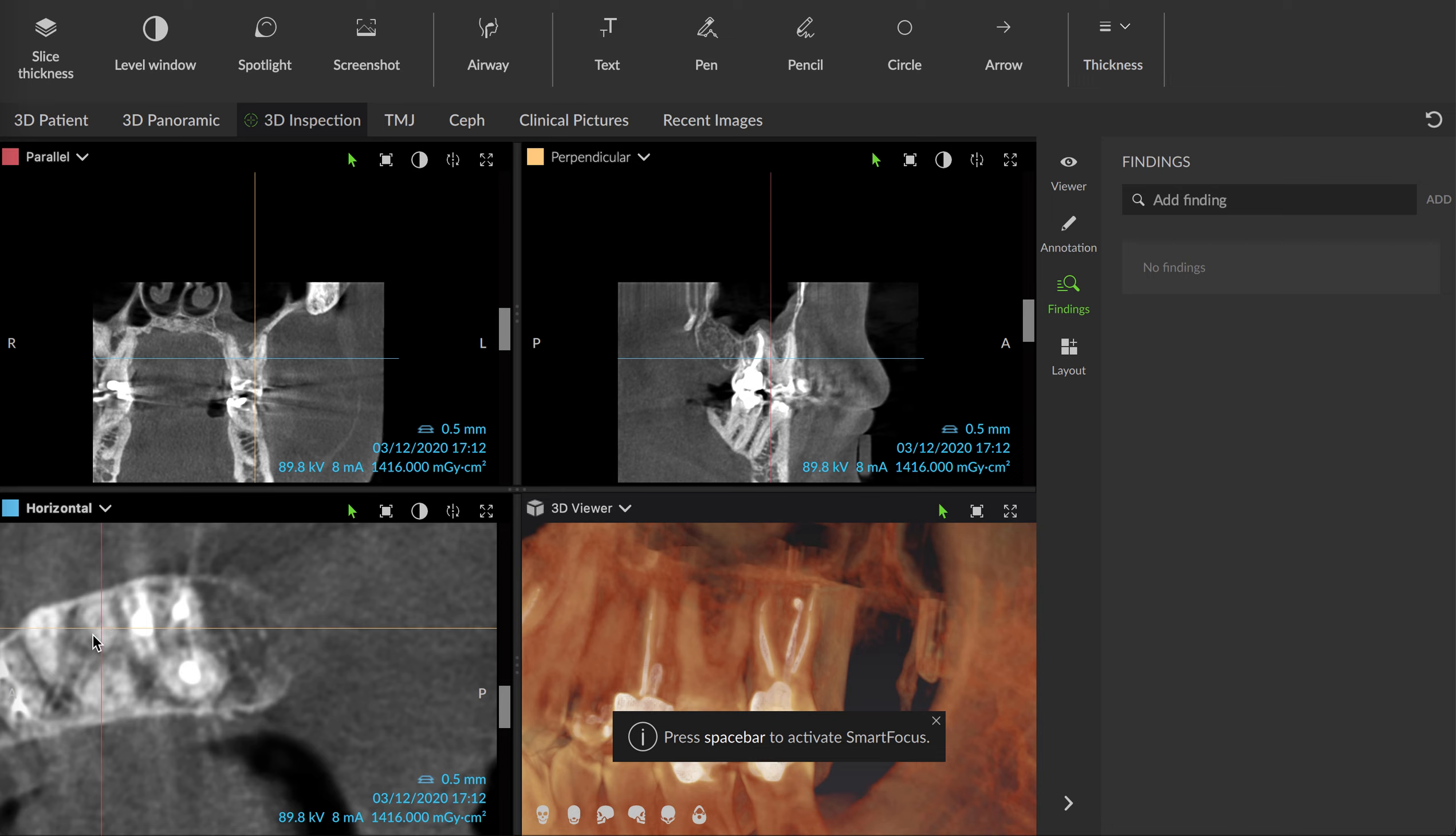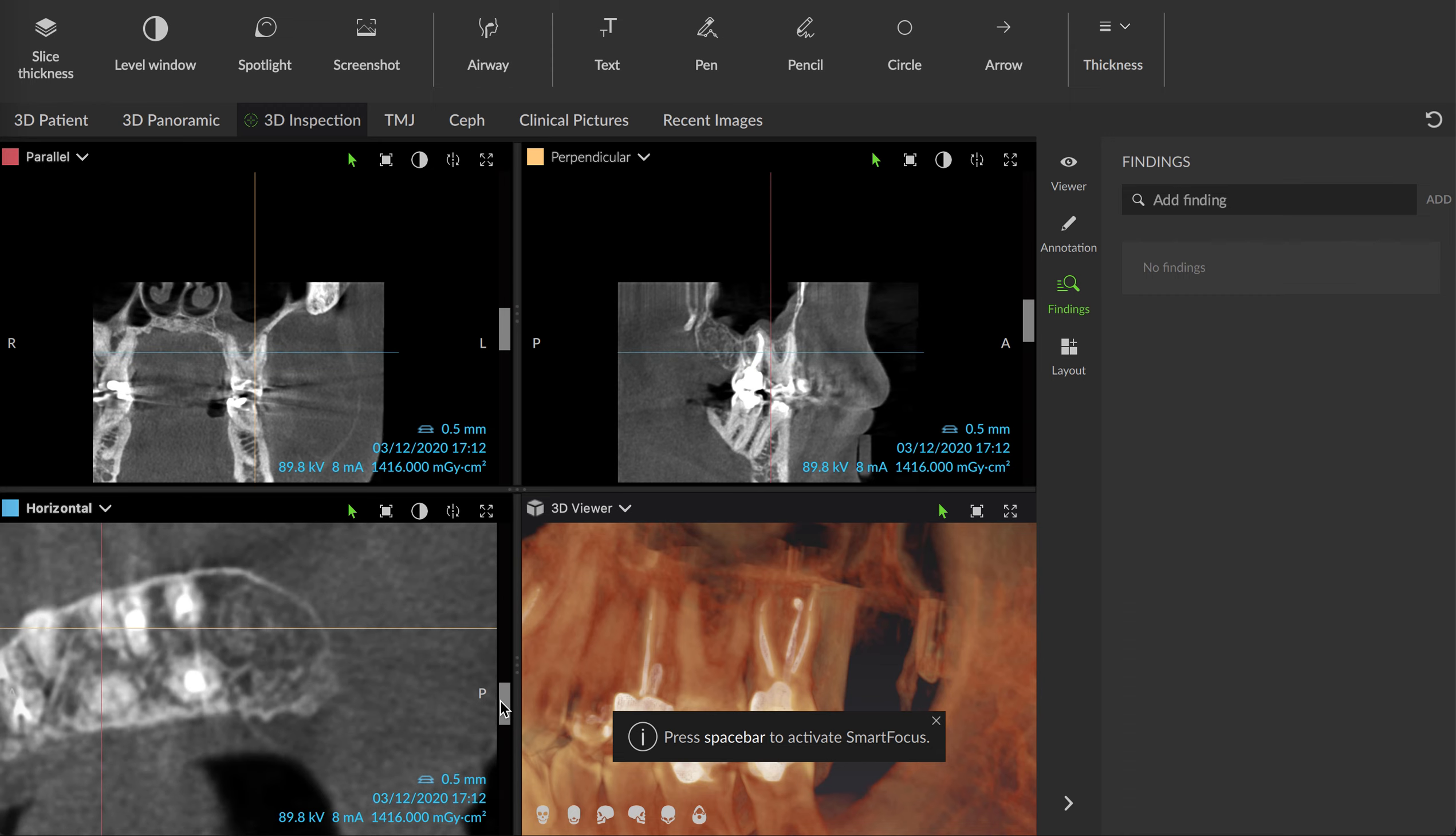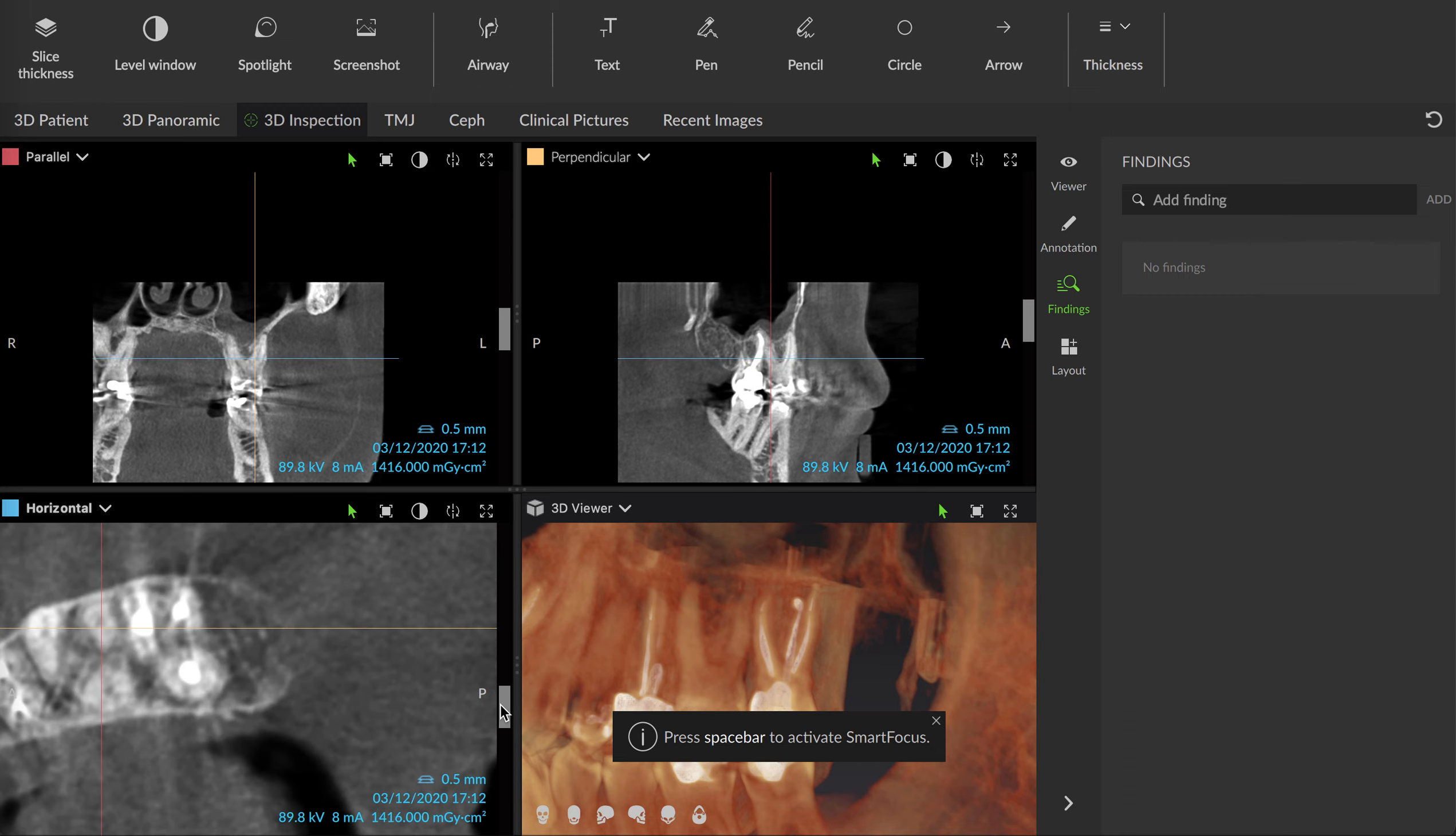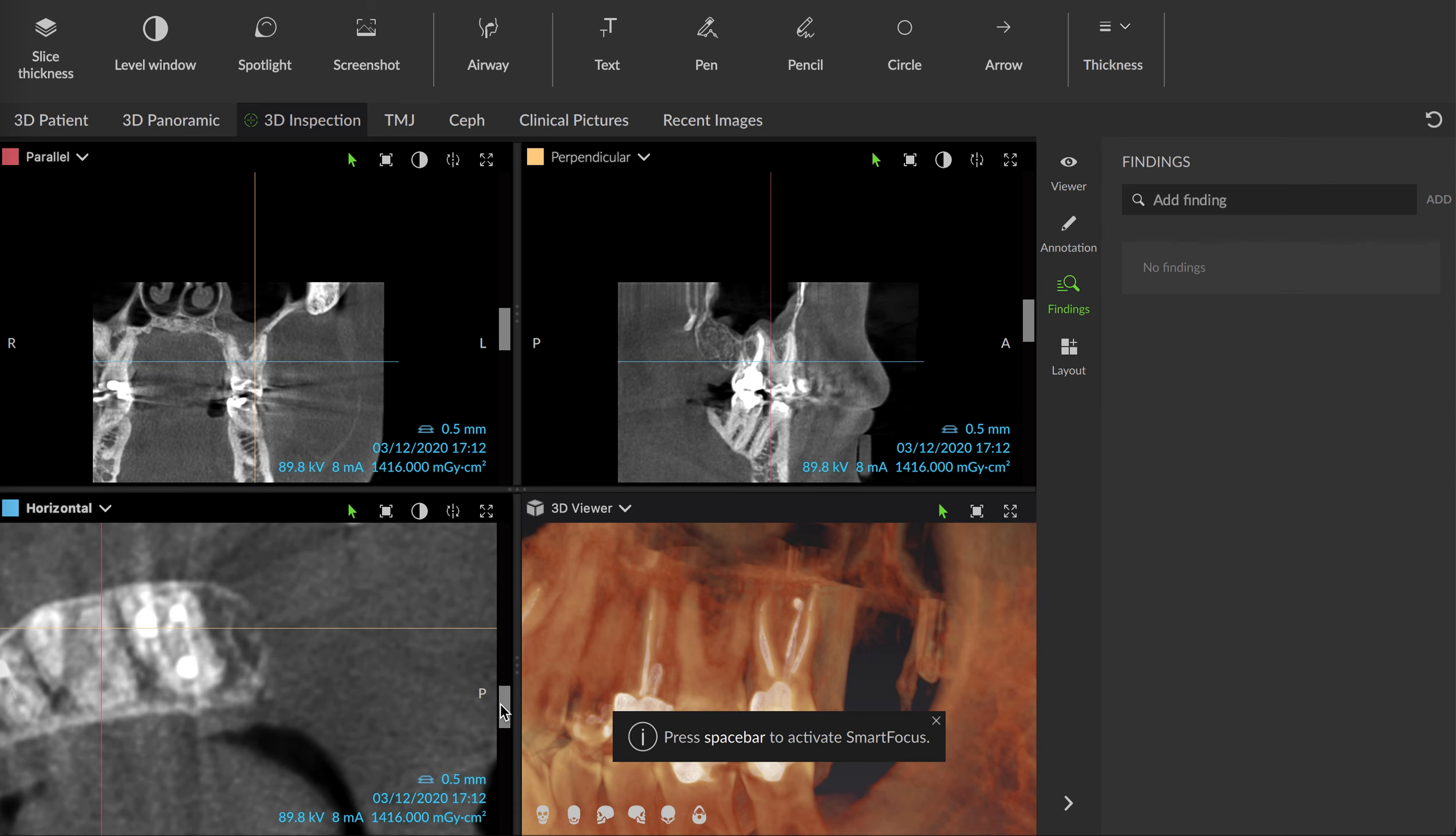I was troughing around in this area, got kind of close, so I took a step back and evaluated with a CBCT, determined exactly where that distal buccal canal was. The palatal and the mesial buccal were easy to find.